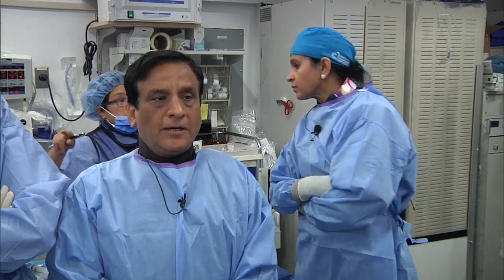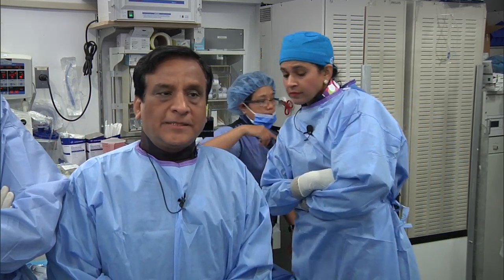Well, we'll time it that way. The key is that most of the work will be done beforehand. Once the sheath has been inserted, I think everything else could be done in 1 hour. As you saw in our June symposium, we did 4 cases on that day, and the actual time taken after your sheath is there probably takes about 20-30 minutes maximum. Excellent.